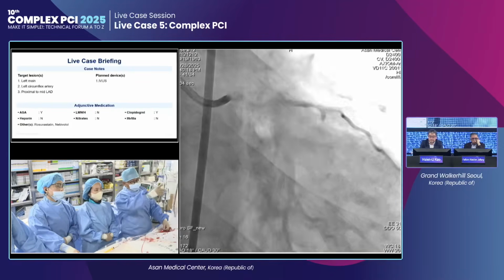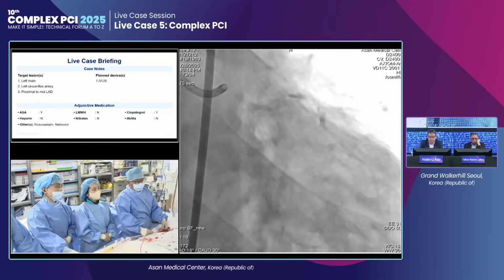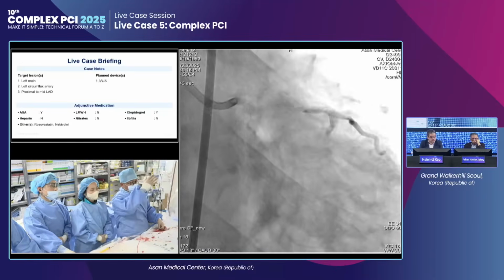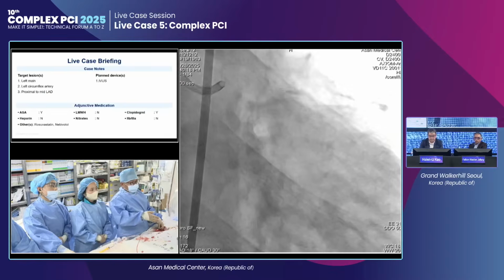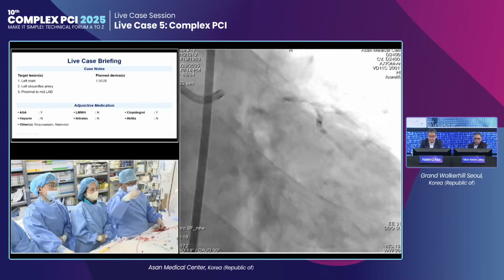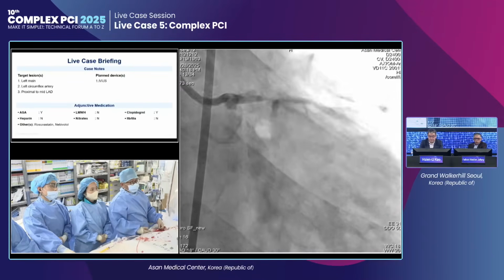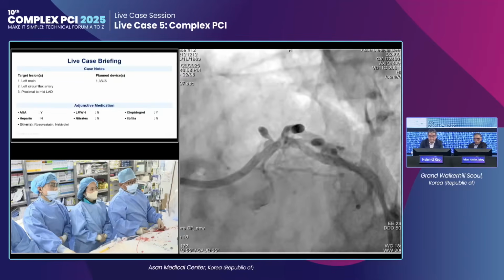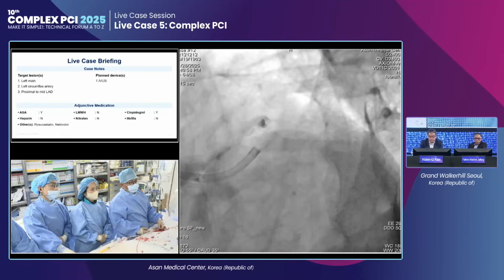So there is some rupture, the left main, and very tight. You can see the very tight stenosis. This is circumflex and small OM and RI, LAD. Next, please. This is a wider view. So, left main quadrification.